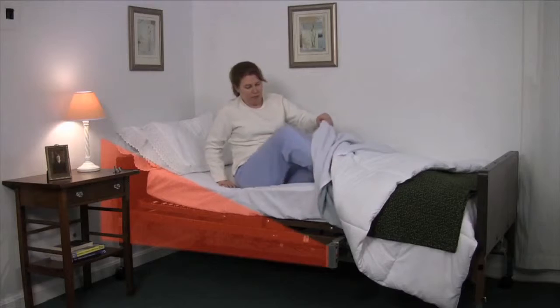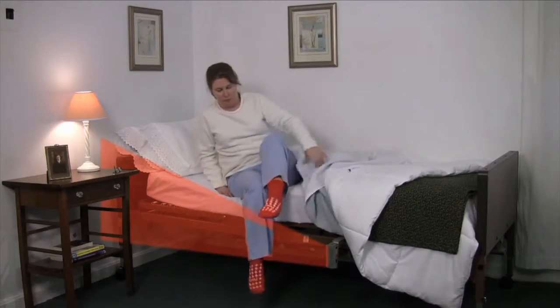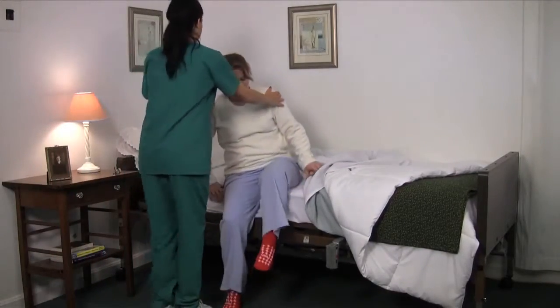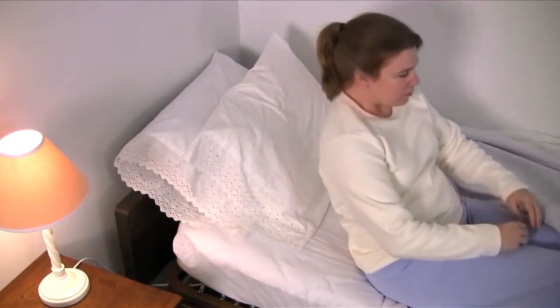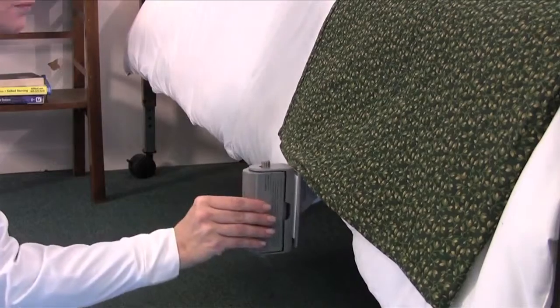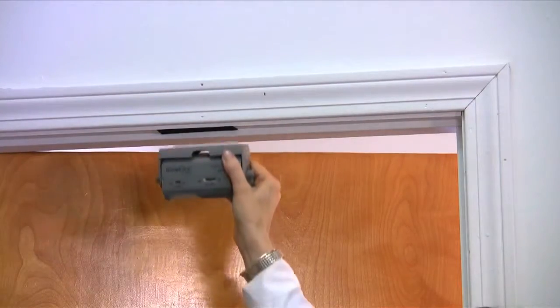There are several advantages PIR alarm systems have over traditional sensor devices. They generate early warnings to patients attempting to wander. They are wireless, so there's nothing to tangle or trip over. They are great for both infection control and incontinent patients because there are no sensor pads to clean. They can be placed just about anywhere to monitor a patient — by their bed and even over the door to detect patients trying to exit the room. And they serve as a covert alarm system that goes undetected by the patient; they won't be able to tamper with the alarm or prevent it from sounding.